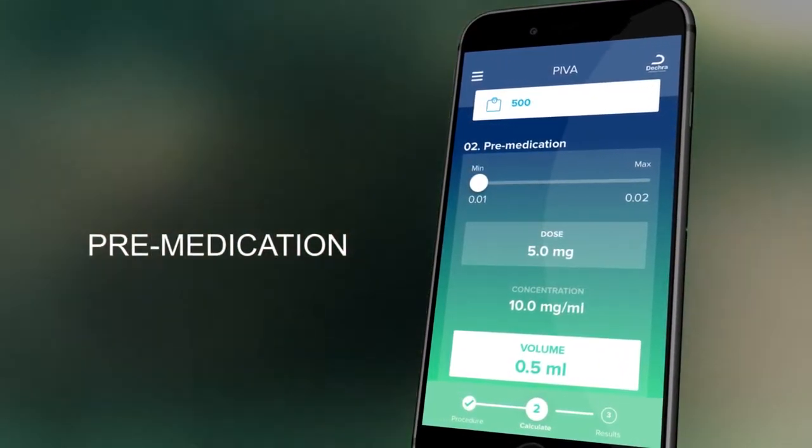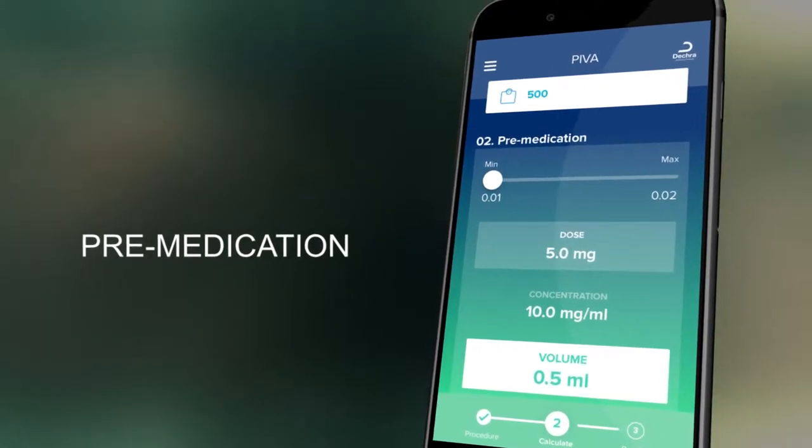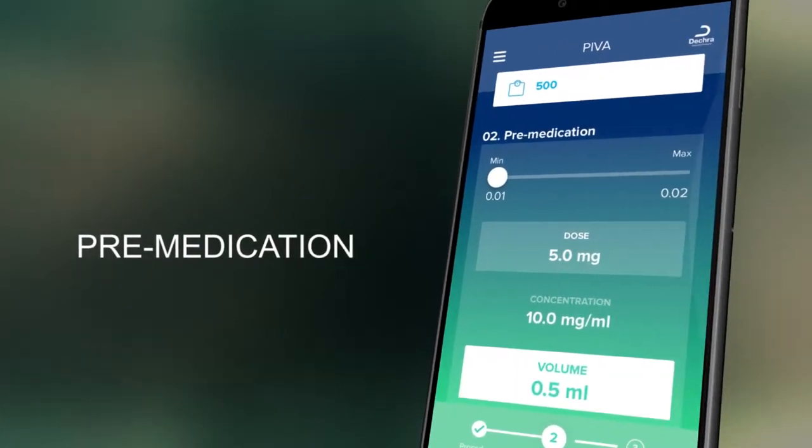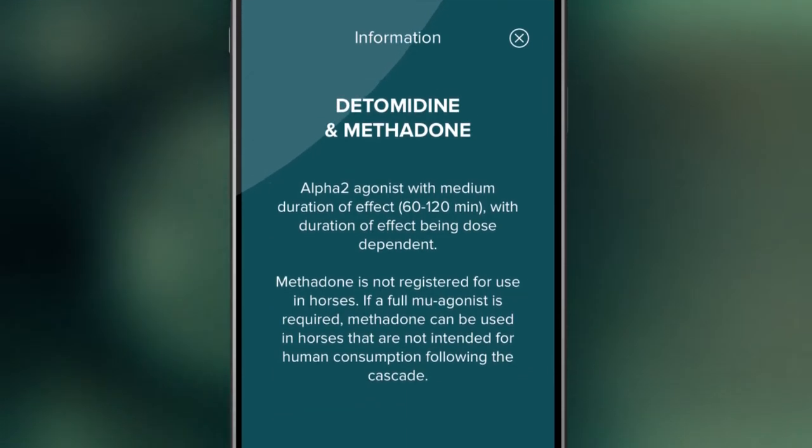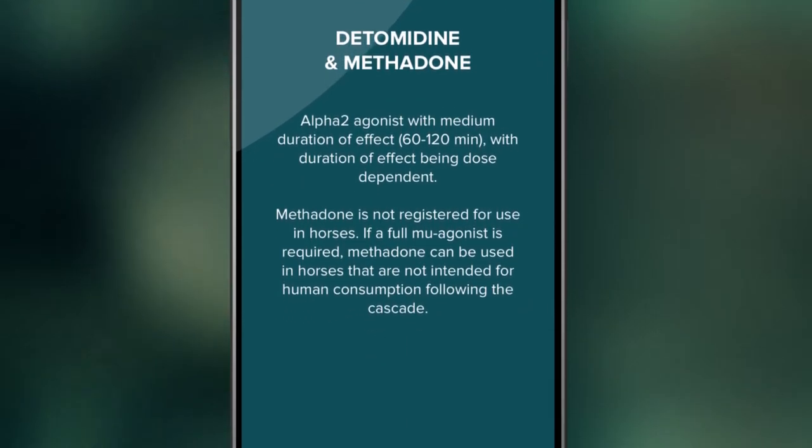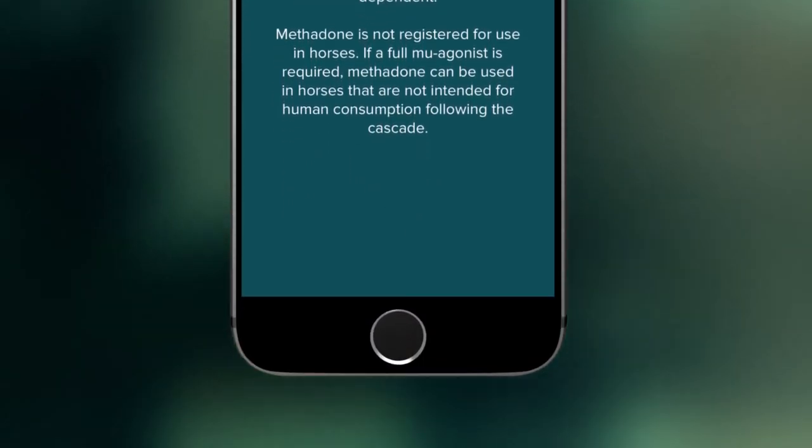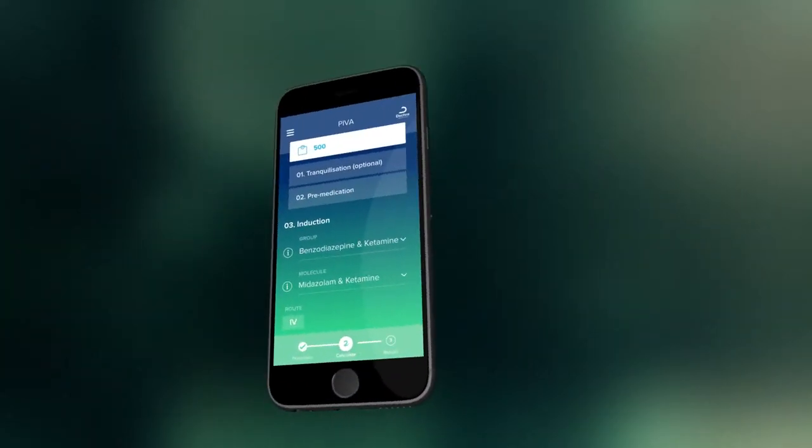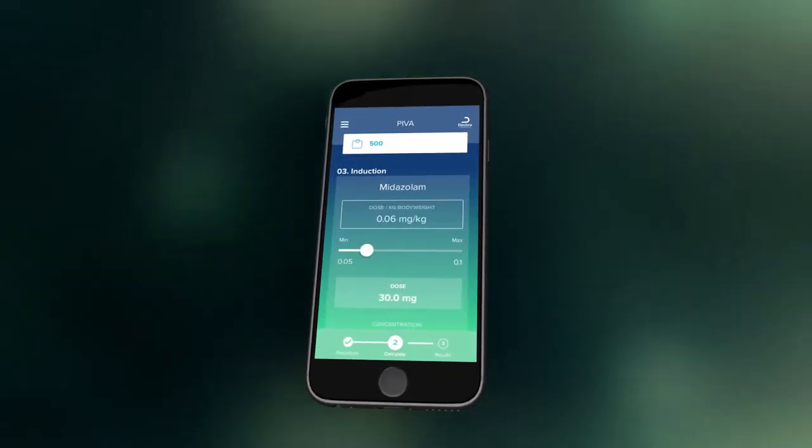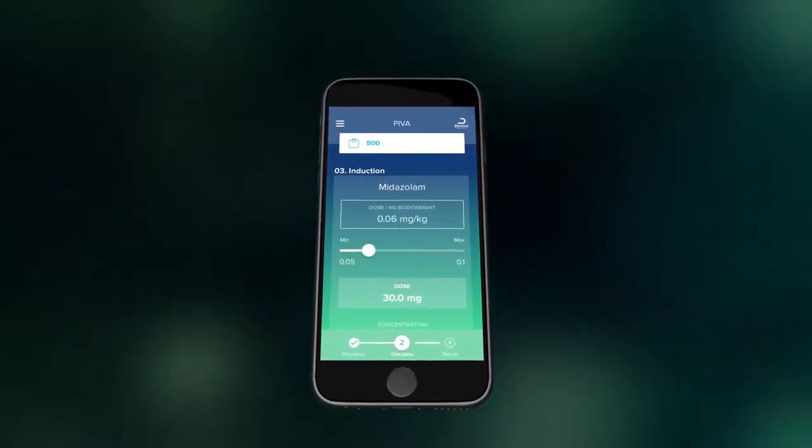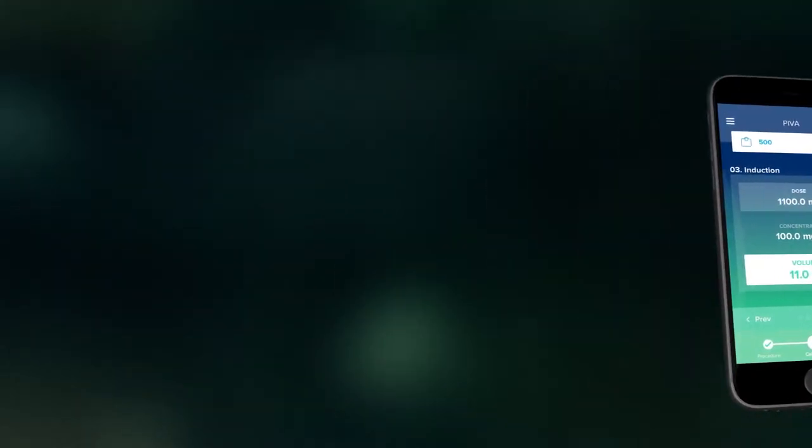Check this is the same concentration as the drug you are using. Additional molecule information can be accessed using the info symbol. You can then choose your induction agent or agents and follow the same steps to calculate the required dose.